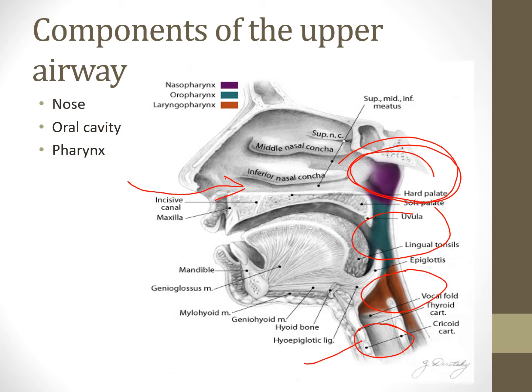And then there's different sizes of nasal trumpets, and we'll get into how to measure that. Because if you put in a nasal airway and it goes too shallow, let's say it terminates right behind the uvula, well, it's not going to do anything to keep the tongue from flopping against the posterior part of the oral pharynx. It's not going to help keep a patent airway. So if you have too shallow of a nasal trumpet or a nasal airway, it's not going to be helpful or beneficial. If you have too long of one, it could actually push itself and curl, or it could even go to the entrance of the esophagus. It could curl into the oral pharynx as well. So it may not be effective either.